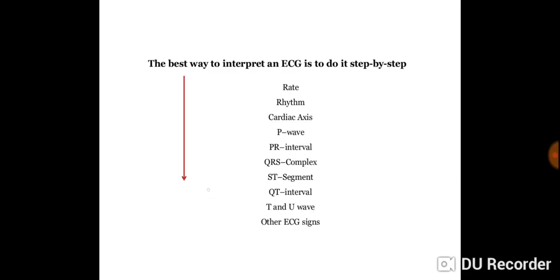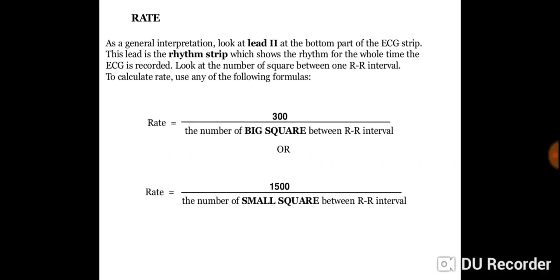These are the things that you need to do in reporting an ECG. In this video we will discuss the rate. My favorite way to find the rate is the second method.